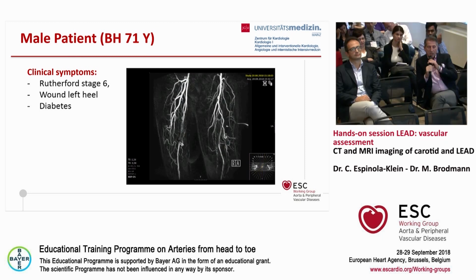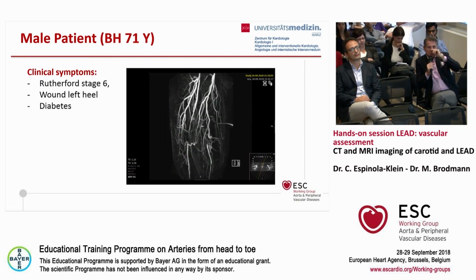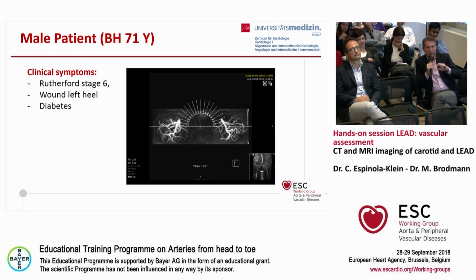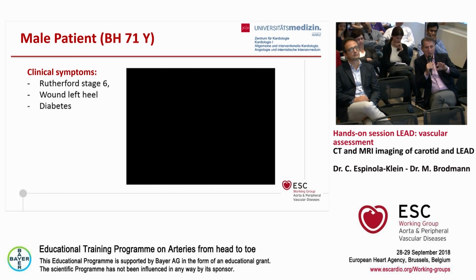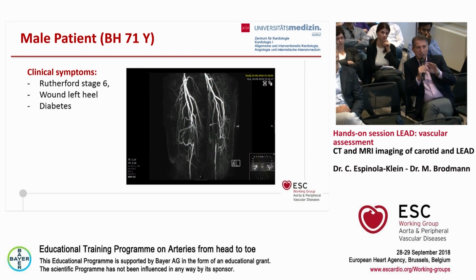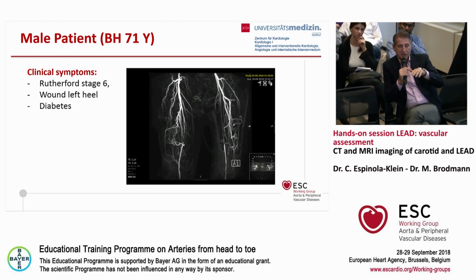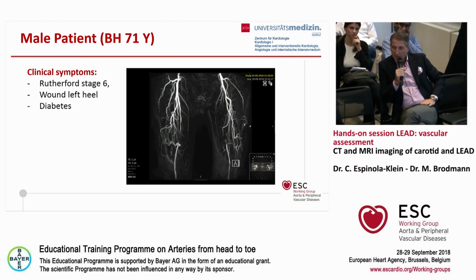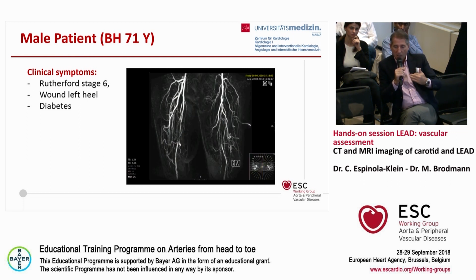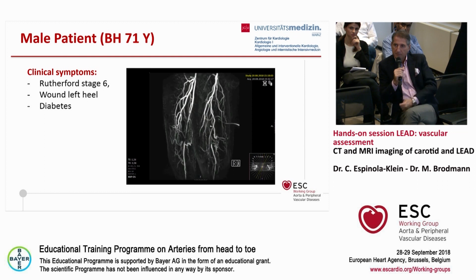Can I make a comment? Yeah. This is a limb-threatening situation. Yes. And so what I need, I'm an interventional cardiologist, is just the approach I have to use to revascularize this patient. So I think that you have the indication to revascularize the patient. If the Doppler ultrasound tells me that I can enter anterogradely in that leg, I don't care about other things. I mean, the occlusions above or below the knee, because I will see what I have to do when I enter. Maybe you can answer that.